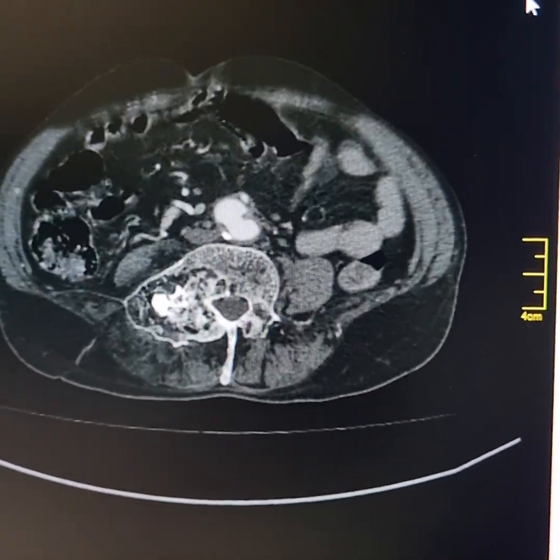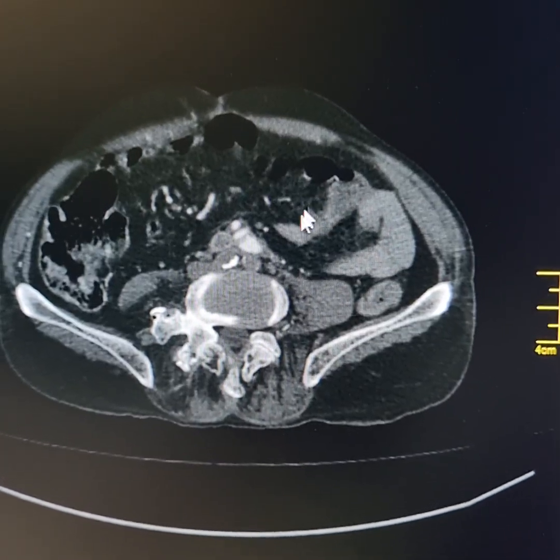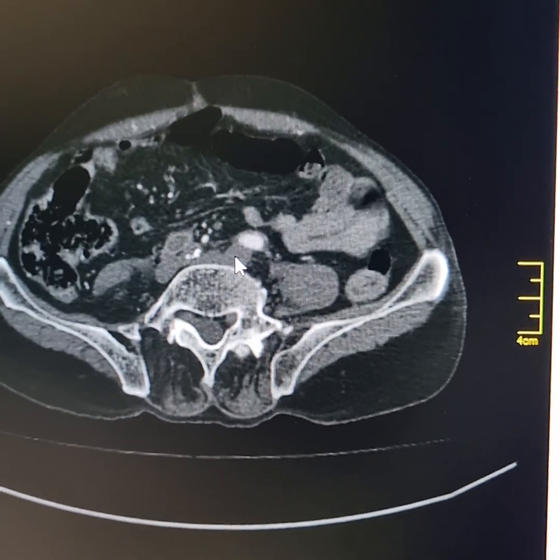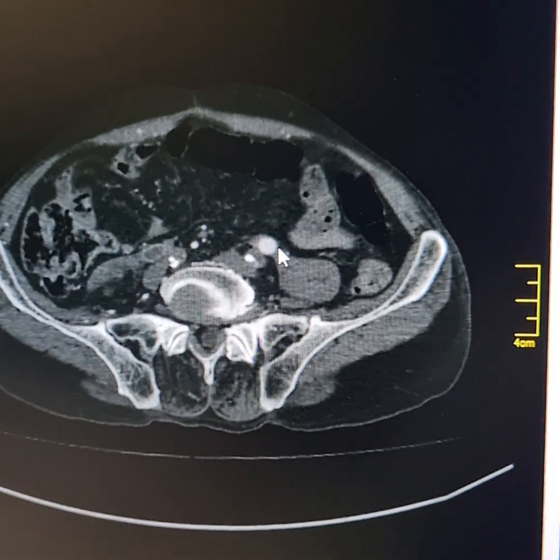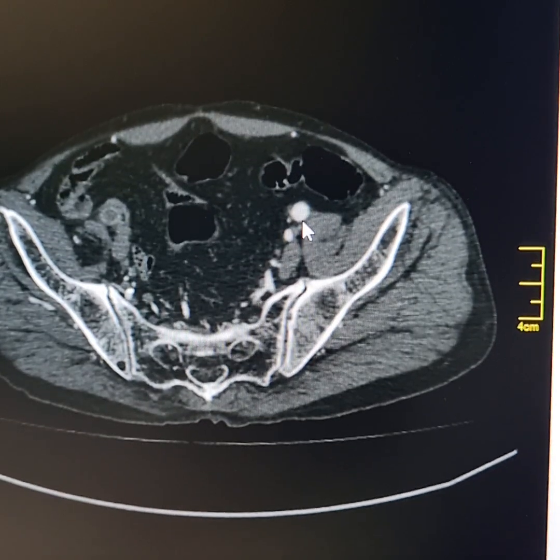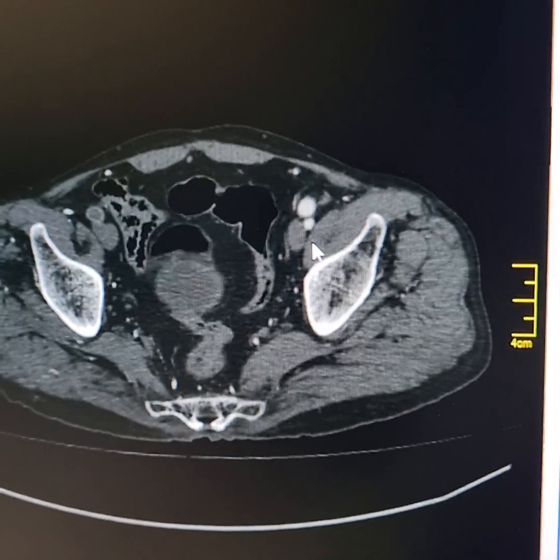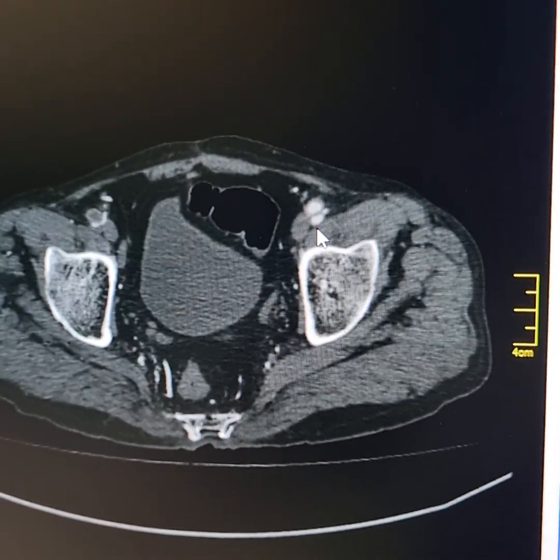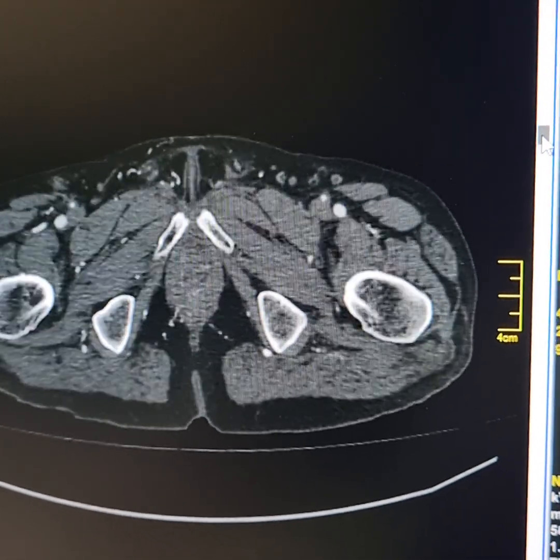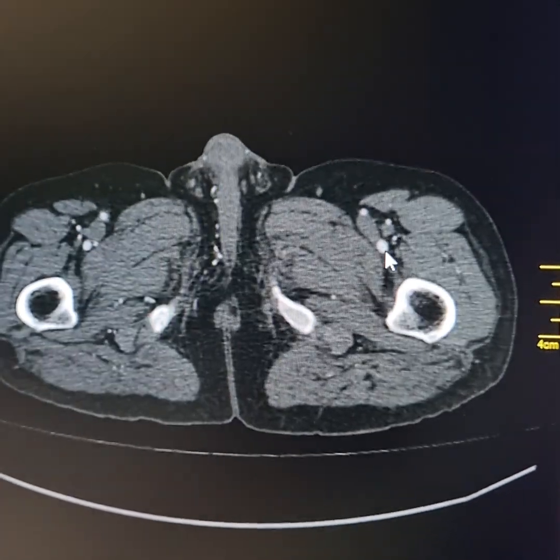left side of the graft and the left femoral and iliac vessels. Now, this is the graft, it is patent. This is the left common iliac artery, which is completely thrombosed. Please follow it down. Calcified atheromatous plaques. This is the graft, quite capacious, well outlined. Now, this is the left external iliac artery, it is patent here. I scroll it down. This is the profunda femoris artery, fairly capacious, its branches.